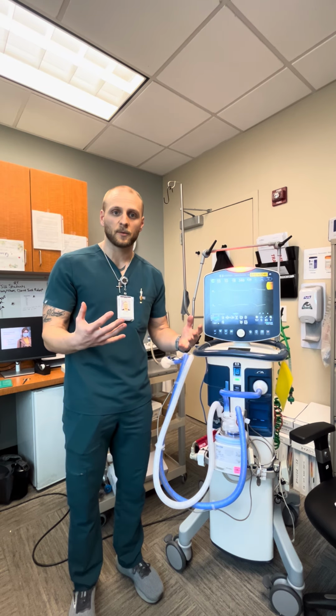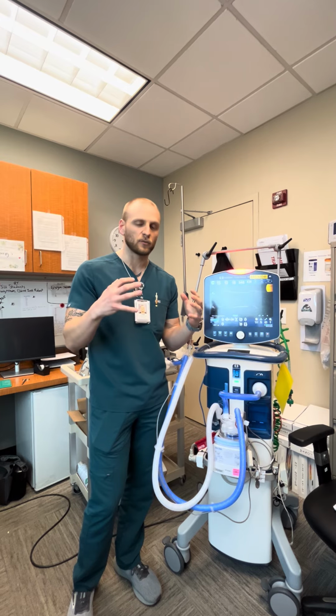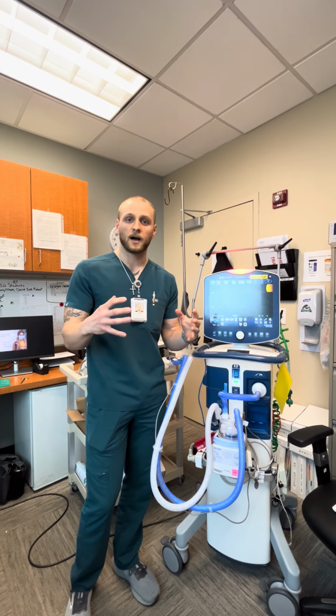Okay, so the number one indication for the use of bilevel is going to be us not being able to oxygenate our patients. Most of the time that'll be secondary to ARDS-like pathways, right? So we have really, really stiff lungs that we just cannot oxygenate whatsoever.